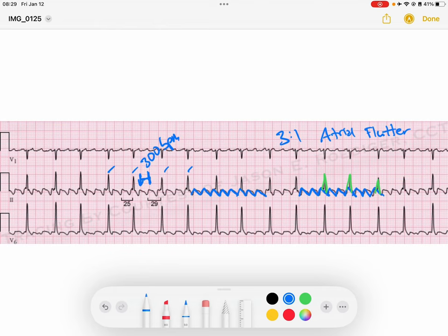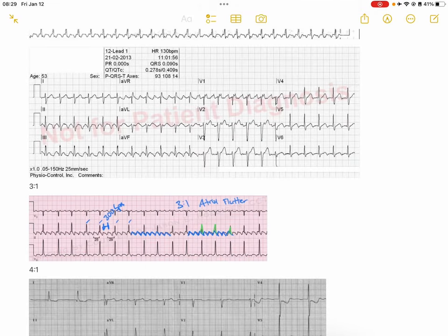In three-to-one atrial flutter, one flutter wave conducts to the ventricles, and then the next two flutter waves find the AV node still repolarizing and unable to propagate that signal until the third one again. Then the process repeats. So that's three-to-one atrial flutter.